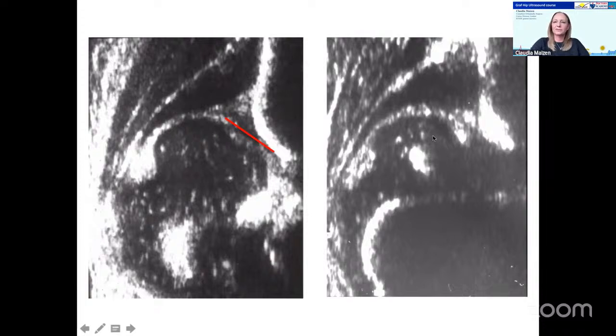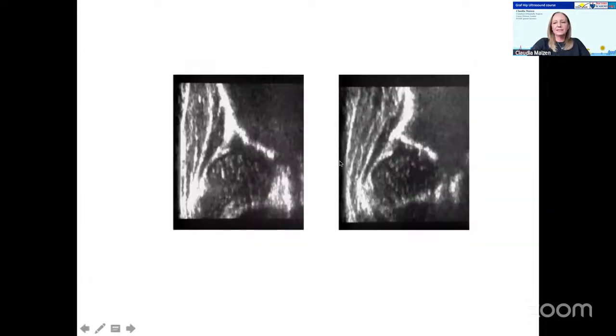We've explained that the hip is moving posterior during the dislocation process. On the right side of the screen, you can see a type 4 hip. Again, of course, we have the labrum above the turning point. Also here, we're not in a standard plane. We must not measure those hips. Now, in this case, we actually have a centered hip, so we should be able to measure, but it does not fulfill our second checklist.